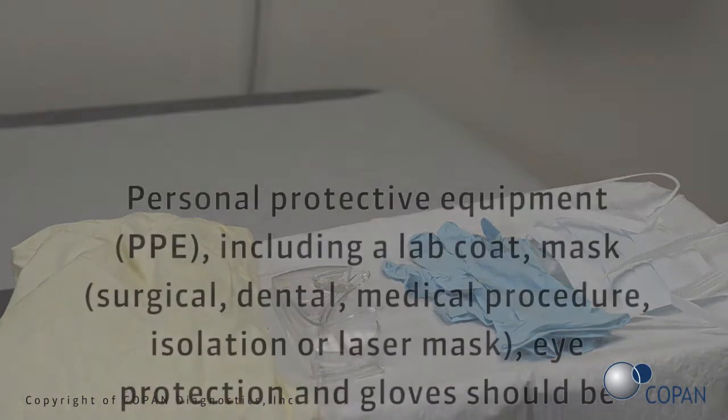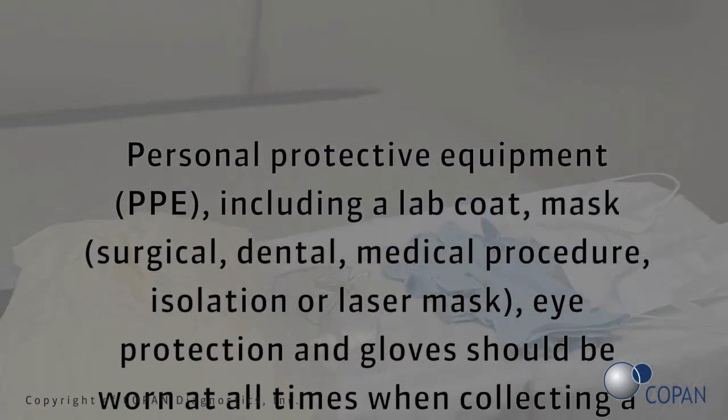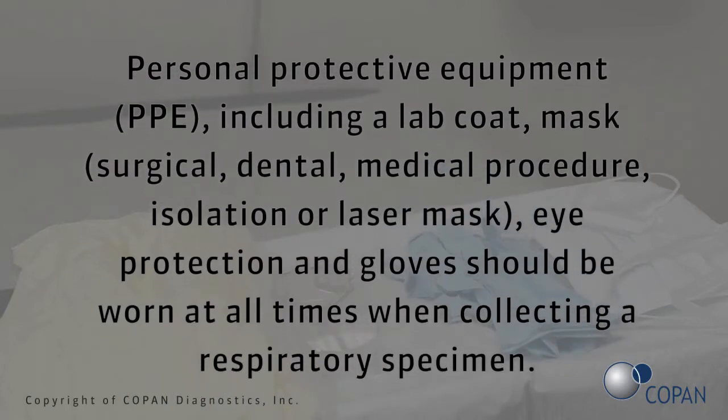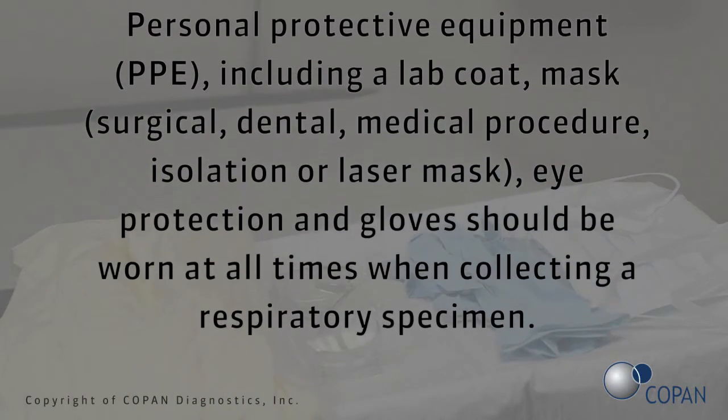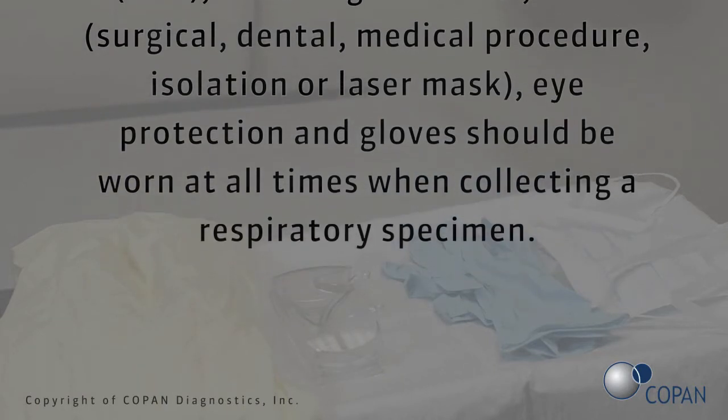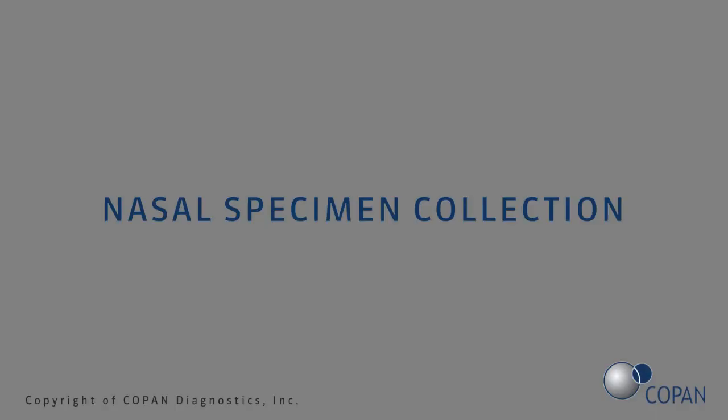Personal protective equipment (PPE), including a lab coat, mask — surgical, dental, medical procedure, isolation, or laser mask — eye protection, and gloves should be worn at all times when collecting a respiratory specimen. To first collect the nasal specimen, check for nasal obstructions.